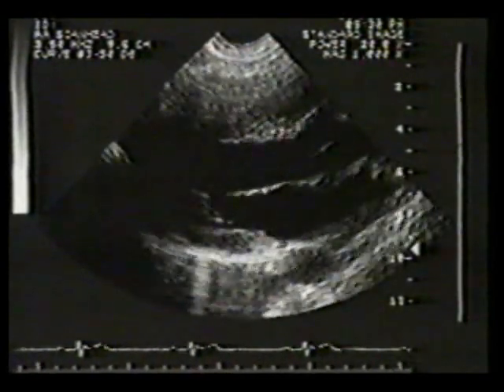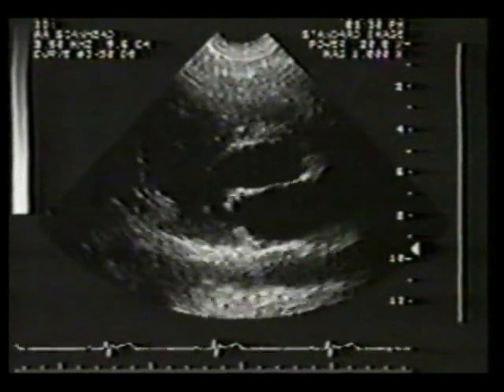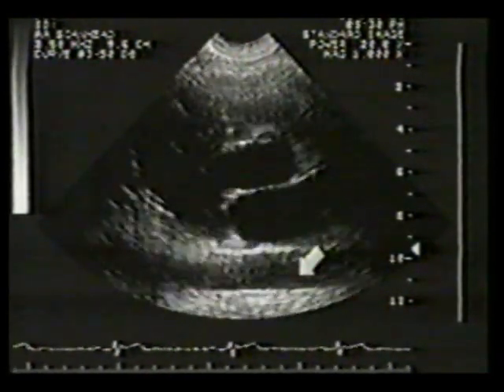Maintaining the left parasternal position, the transducer is rotated clockwise to develop the long axis view of the descending thoracic aorta.